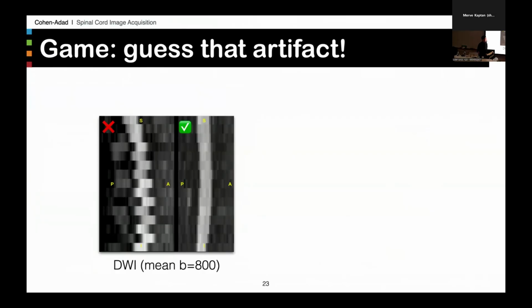So on Siemens and GE, if you want to do reduced field of view, you would use 2DRF. On Philips, it's different for the diffusion weighted sequence. You would basically use refocusing gradients that are orthogonal to each other. So some of the spins would be refocused and some would not. It's a similar principle when you want to do MR spectroscopy in order to just excite one particular voxel. So that's the technique they use on Philips.